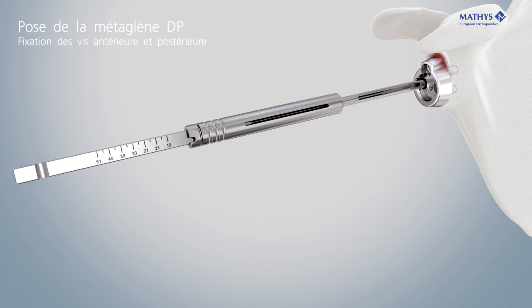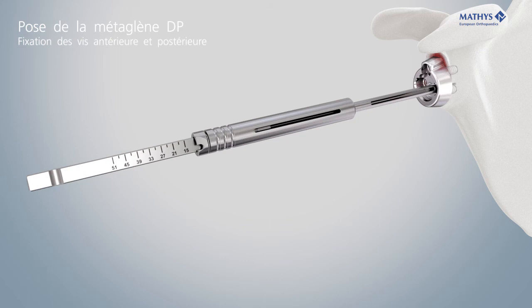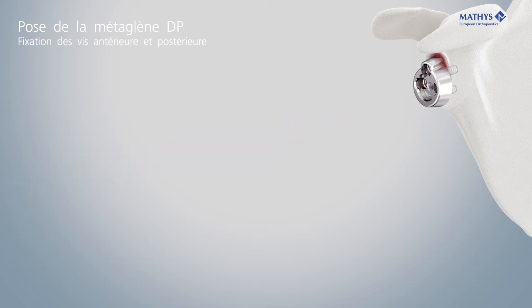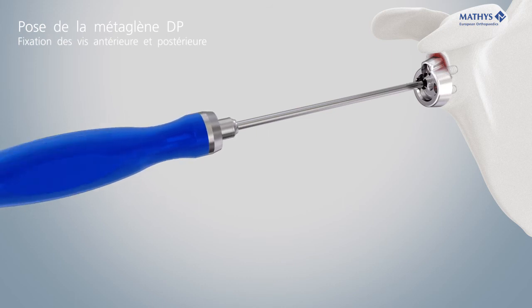Measure the depth of the holes with the depth gauge LC in order to determine the appropriate screw length. Insert the two screws with the screwdriver T20 and tighten them alternately.